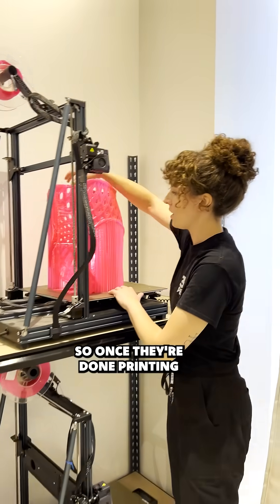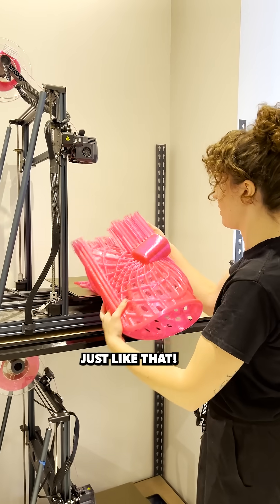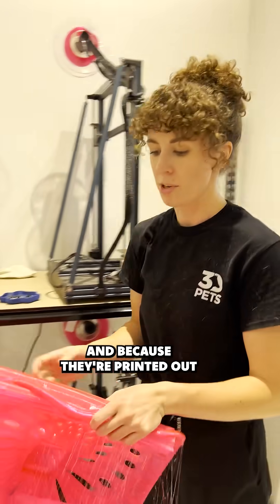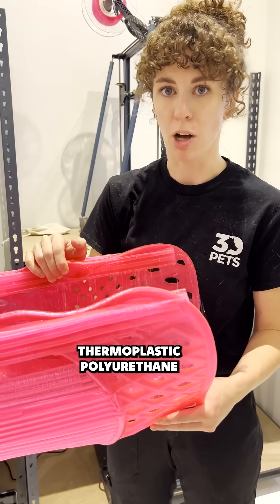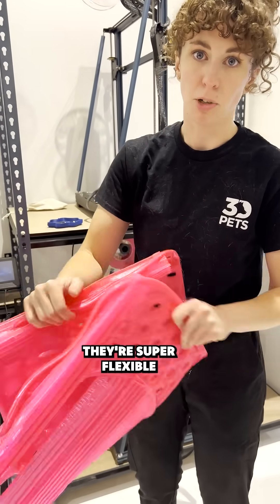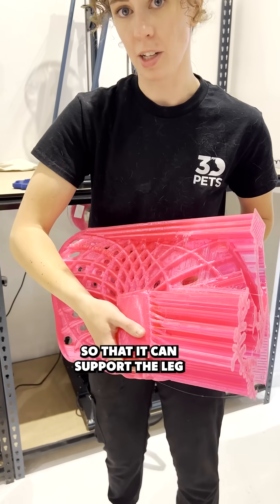So once they're done printing, we pull all the printers — just like that. And because they're printed out of a material called TPU, which is a thermoplastic polyurethane, they're super flexible, which helps the dogs to breathe. They're also rigid where the mount is, so that it can support the leg.